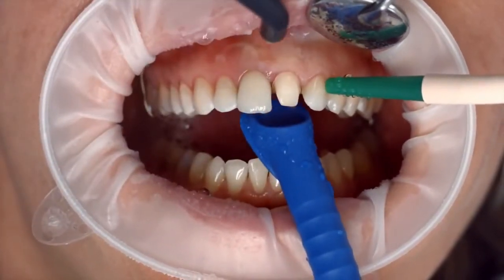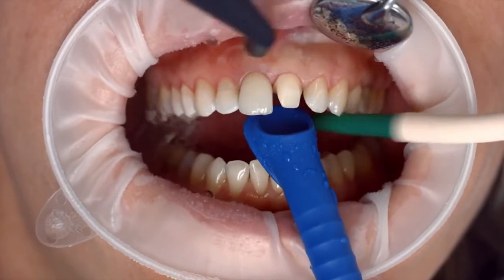Thoroughly rinse off the Try-In paste with water spray after try-in and dry the preparation with water and oil-free air.